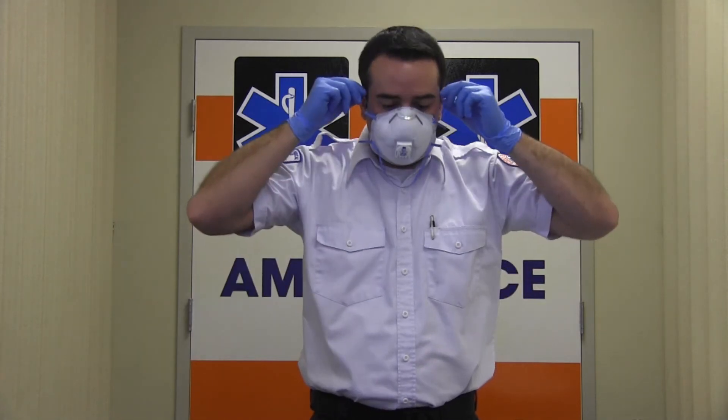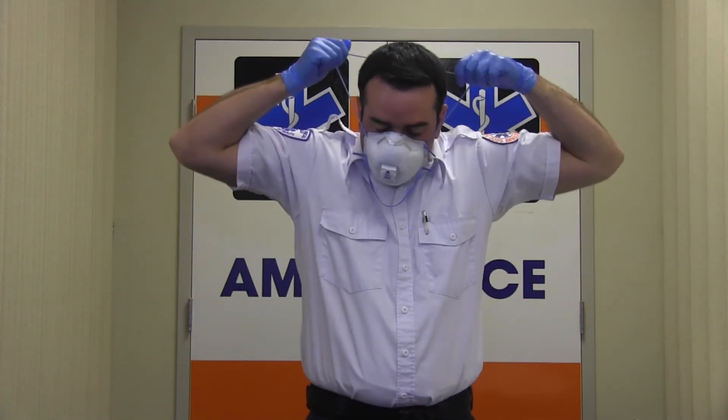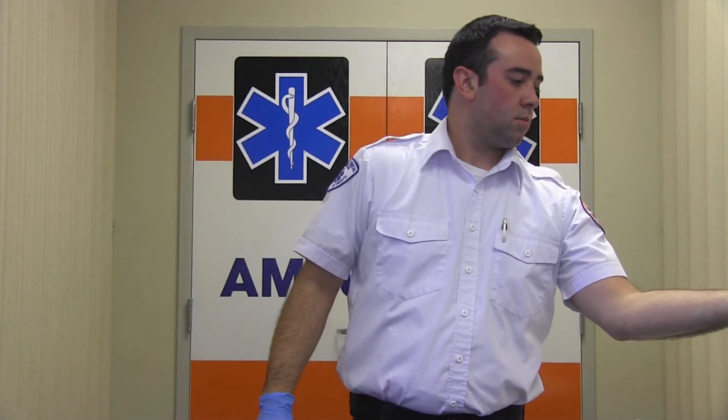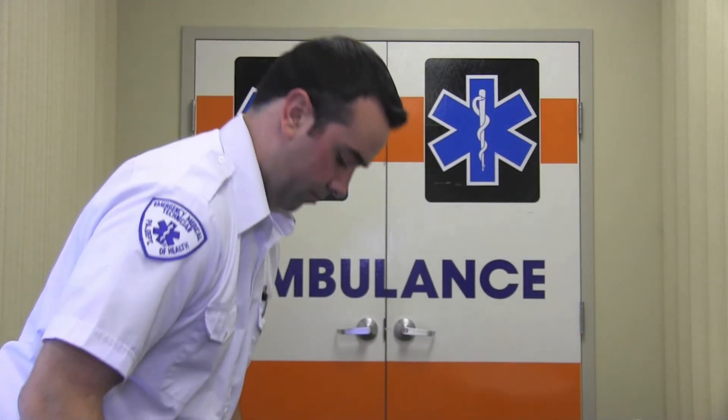Now you will remove your N95 respirator by tilting your head slightly forward, grasping first the bottom strap, and then the top strap, and removing the mask without touching the front of the respirator. Discard the N95 respirator. Again, you will disinfect your gloves with an alcohol-based hand rub.